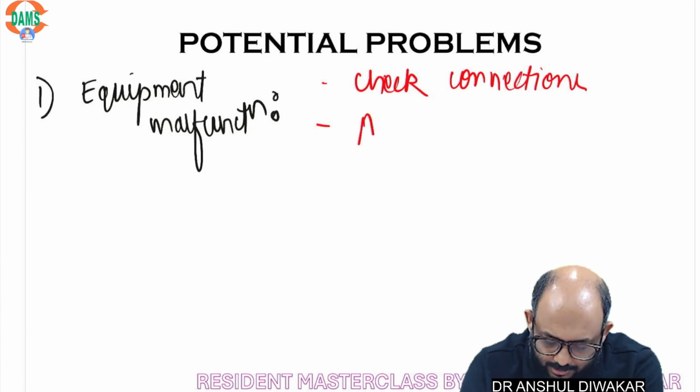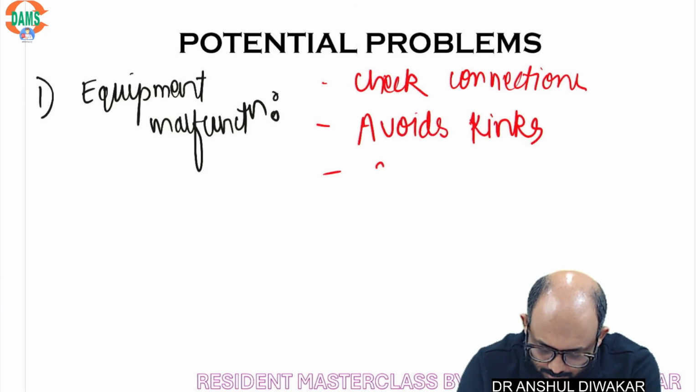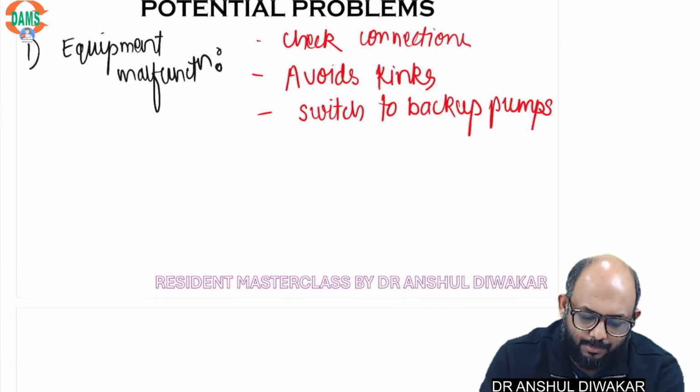You can avoid kinks in the IV line, in the infusion lines, and switch to backup pumps.